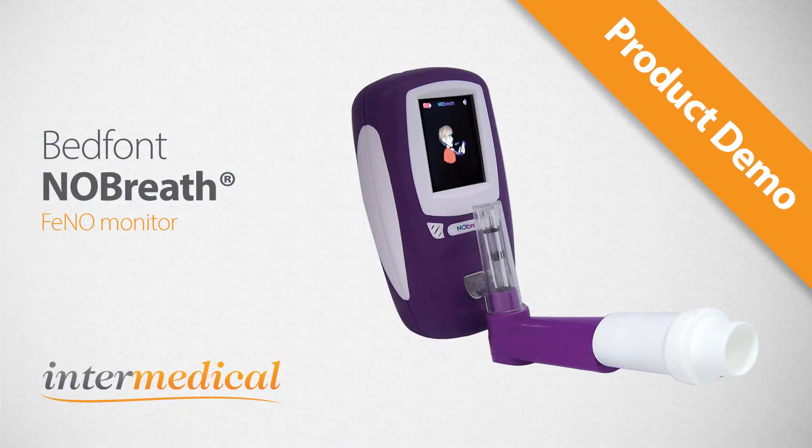Welcome to the video demonstration for the Bedfont No Breath Pheno Monitor. The monitor will measure fractional exhaled nitric oxide in the breath in parts per billion.